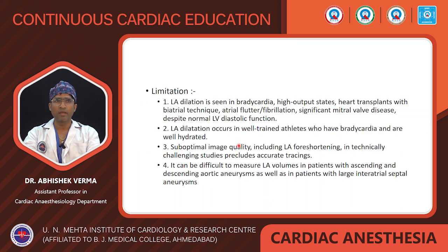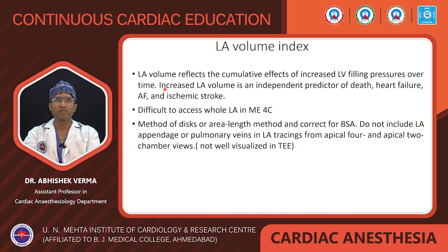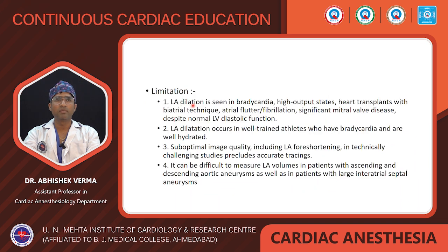In TEE, what actually happens, we will show in a diagram. But first we see the limitations. In patients with LA dilation, which is seen in bradycardia or high cardiac output states, or heart transplant with the biatrial technique, atrial flutter or fibrillation, significant mitral valve disease, or despite normal LV function, the LA volume index is not a good parameter in these diseases.